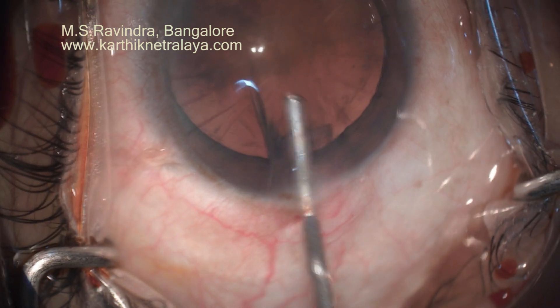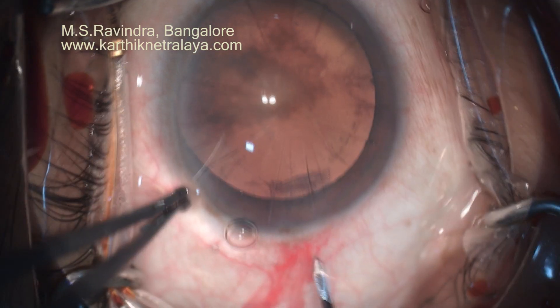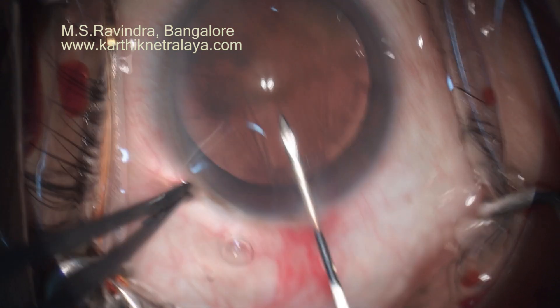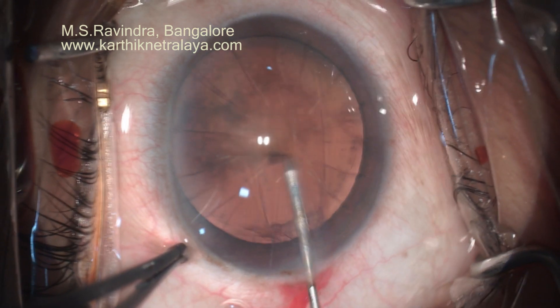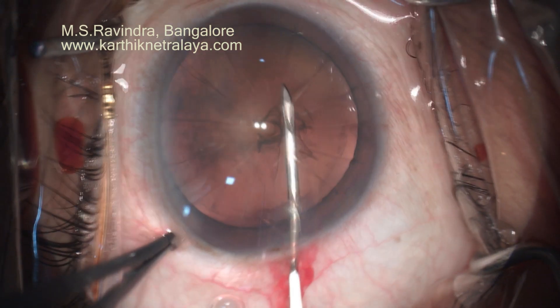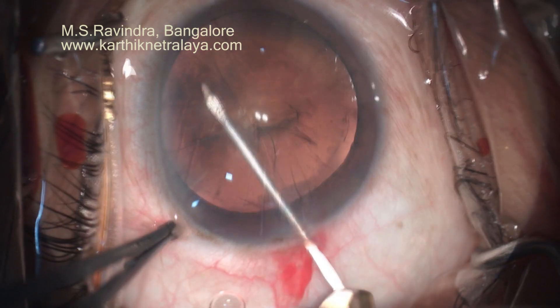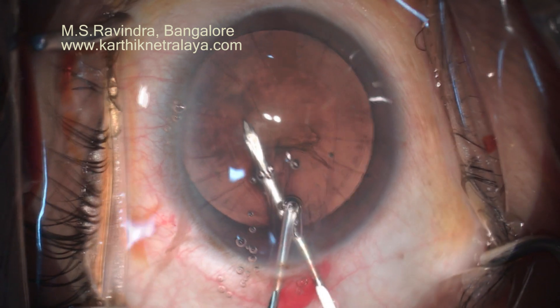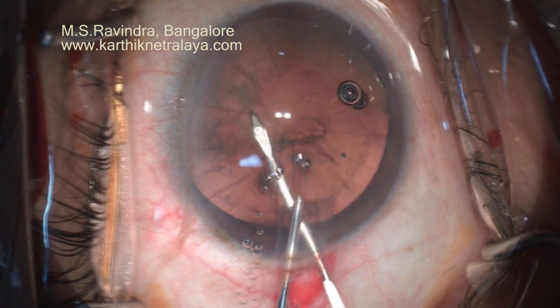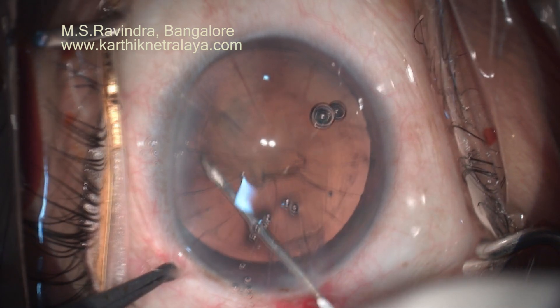With a small conjunctival flap, the keratome enters the anterior sclera and goes across the limbus and the cornea. The IOL power is calculated based upon the true net power of the Pentacam, which takes into consideration the anterior K reading as well as the posterior corneal curvature readings. Only the central and the first ring of the two net calculations were taken into consideration, and Barrett Universal 2 gives excellent estimation of the IOL needed.